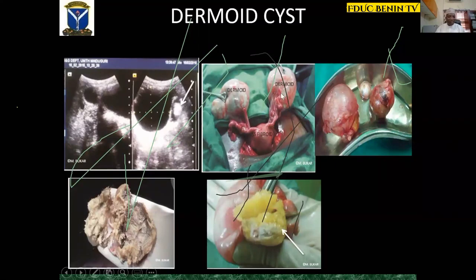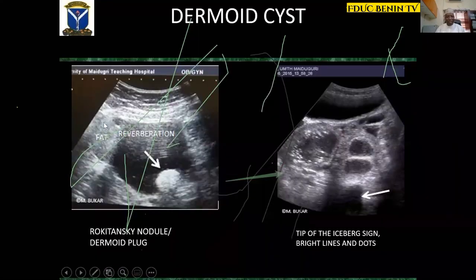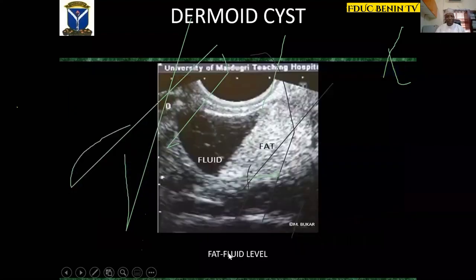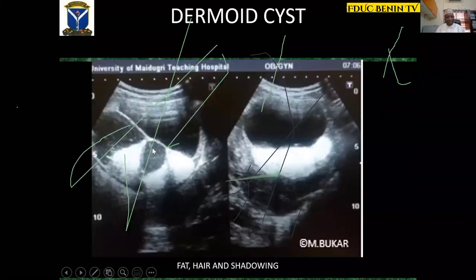Dermoid is bilateral in 10 to 50% of cases. This is a Rokitansky nodule or dermoid plug — it also contains cartilage. You can see a fat globule, reverberation artifacts, bright lines and dots representing hair, and thick bands behind which you have acoustic shadow — this is called the tip of the iceberg sign. Fat-fluid level is seen in about 30% of cases of dermoid. All features of dermoid — fat, hair, and shadowing — are seen here. The cyst has occupied the position of the uterus, and malposition is an important feature of ovarian torsion.